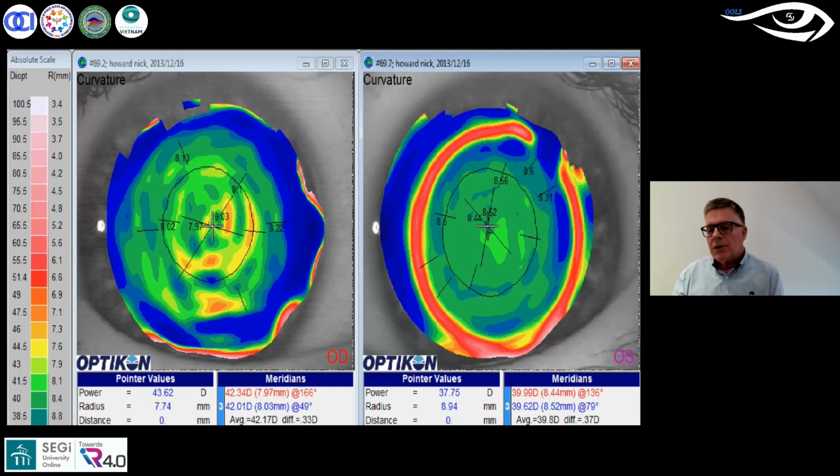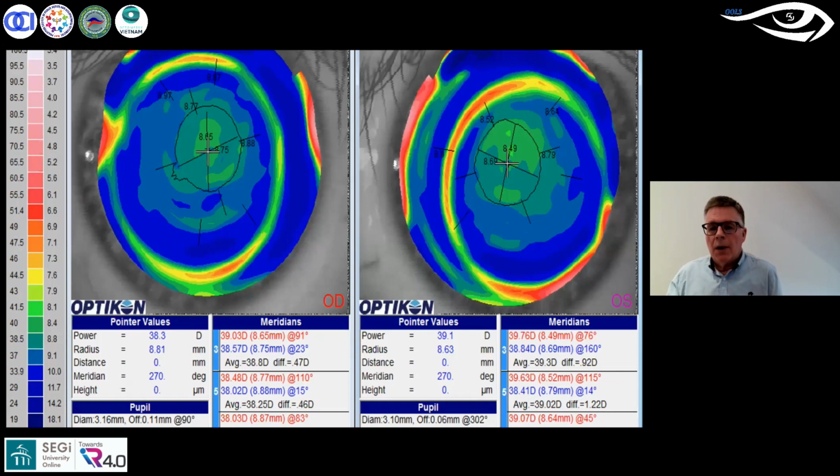Now, on a spherical lens with a millimeter or so of decentration, this wouldn't necessarily matter. But the next image is very interesting. This is one of my colleagues from the hospital, and she's wearing spherical soft contact lenses. You can see that both contact lenses decenter slightly temporally, and that's in keeping with our Victorian friends back in 1889. They knew all about this.